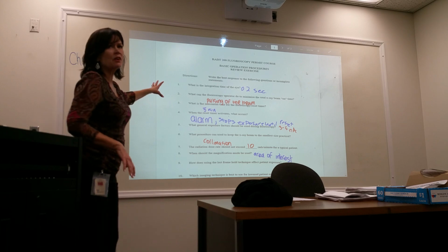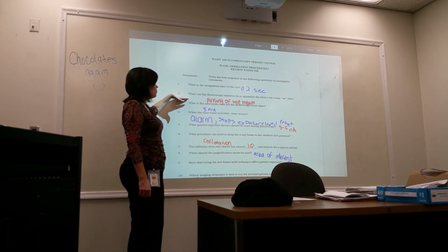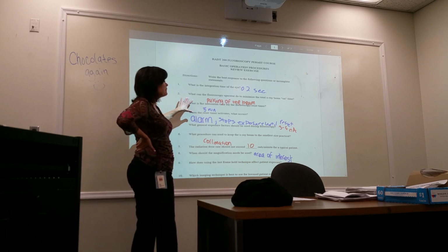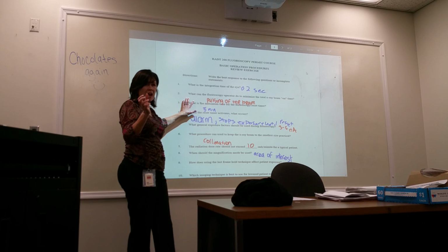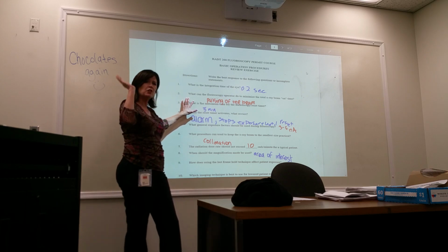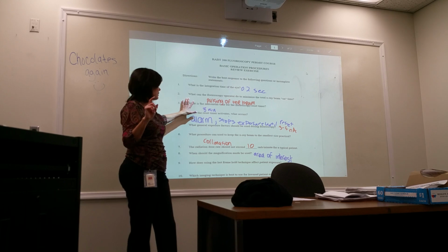So let's go over what we have right now. What's the integration time of the eye? 0.2 seconds. What can the fluoroscopy operator do to minimize dose? Pulsing of the beam, intermittent. They can do that physically. The fluoro beam is also pulsed. It doesn't have to be, but typically it is. And then stepping on the dead man switch and coming off of it gives you that last frame hold, which we'll talk about in a second.